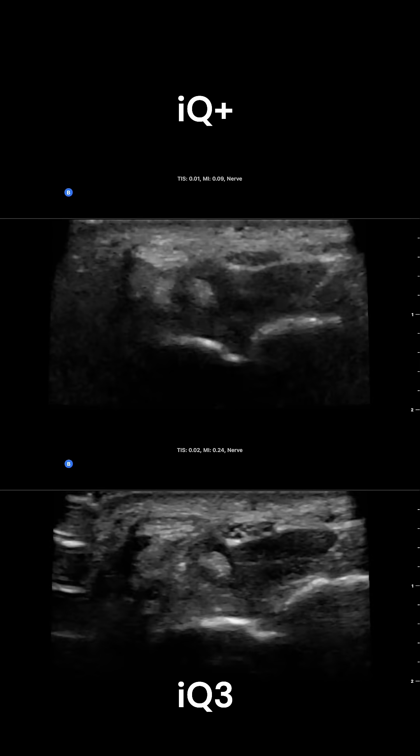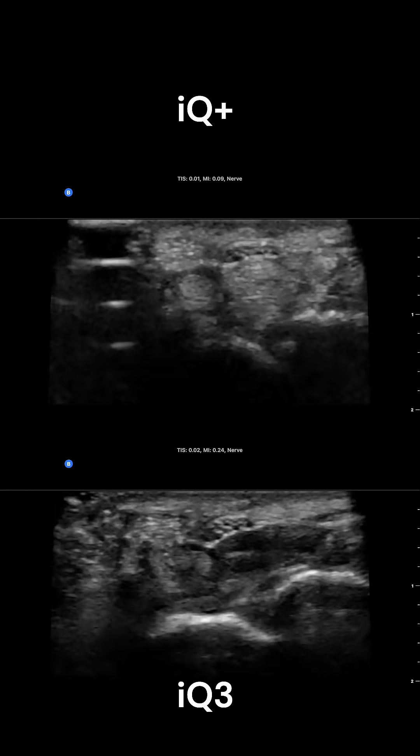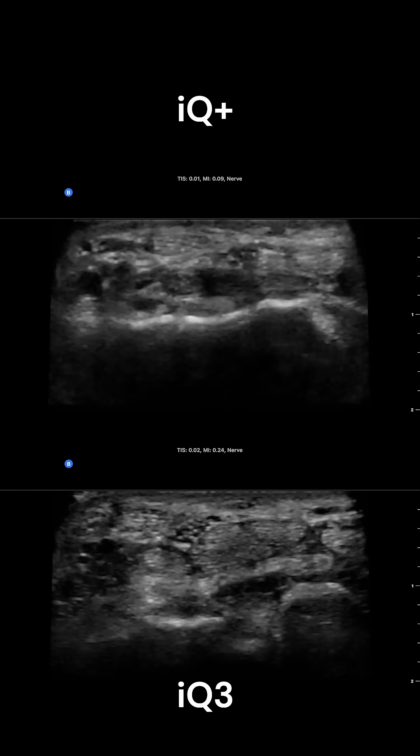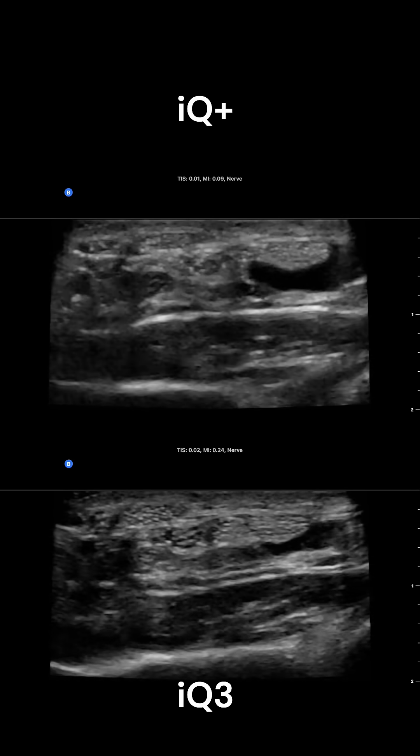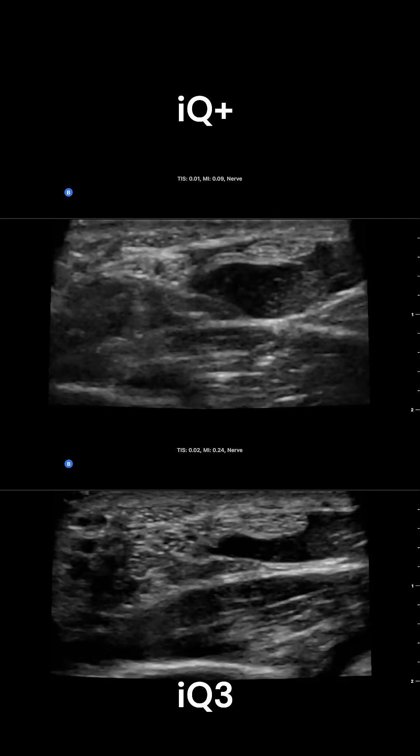We see the same thing scanning the median nerve from distal to proximal. The IQ3 on the bottom really seems to have more detail and helps that nerve pop out from the surrounding tissues.